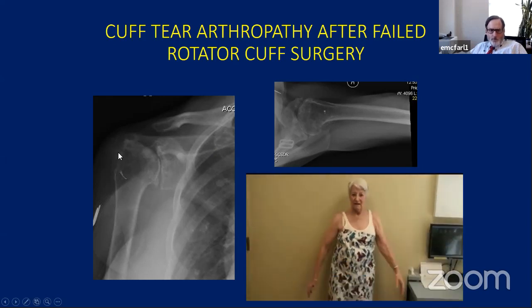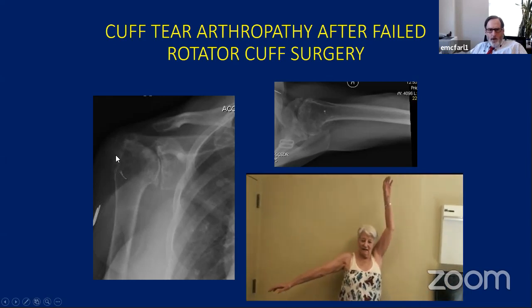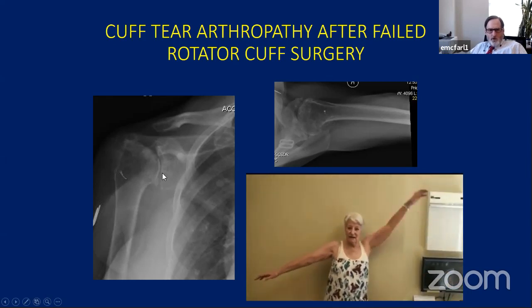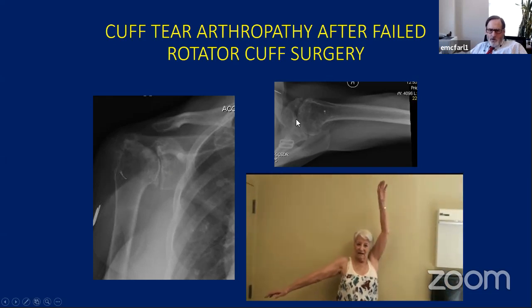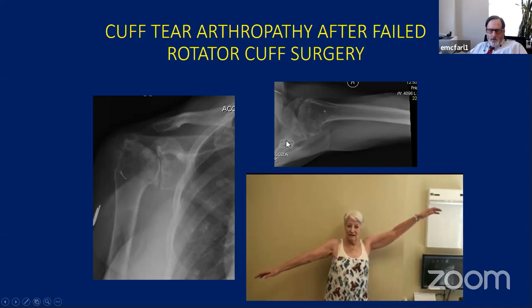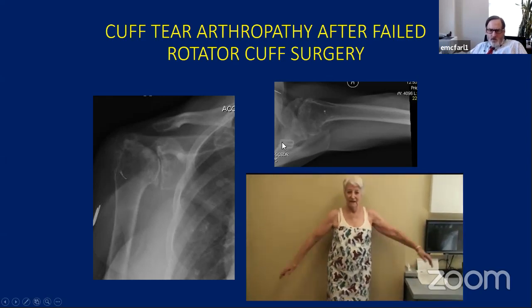This is a patient who had a failed rotator cuff repair, and you can see that over part of this is from her surgery, but she's just gradually over time worn her greater tuberosity away. Again, you can see she's superiorly subluxed, so you get this sort of double image in the glenoid. And here's her axillary. Again, she has pretty good glenoid bone, but if you're in doubt or have any questions, you get a CT scan.